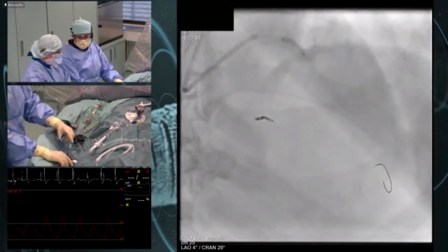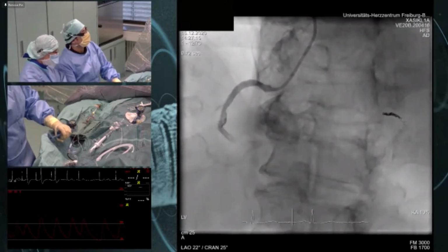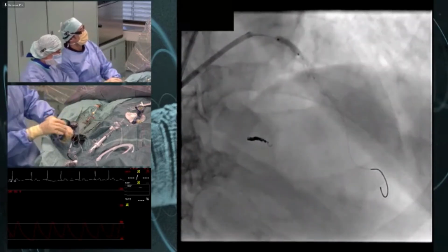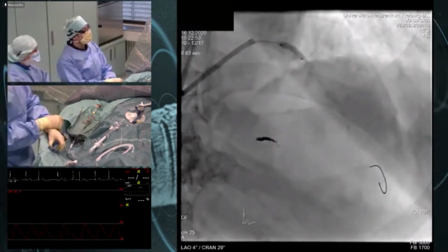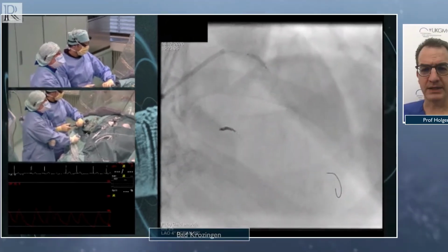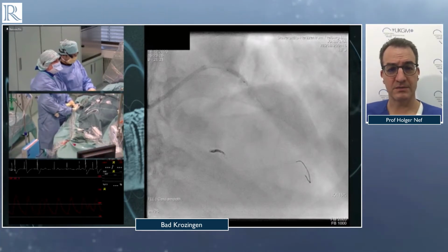Now look here, it's even better precision. I did a little bit of pullback in the meanwhile. Can you see? This was the first application, this was the second. I will make one video. There is some reduction of the bony... So we go in this position, we go a second time. I agree completely that there's a nice effect of the lithotripsy, even after 20 pulses.